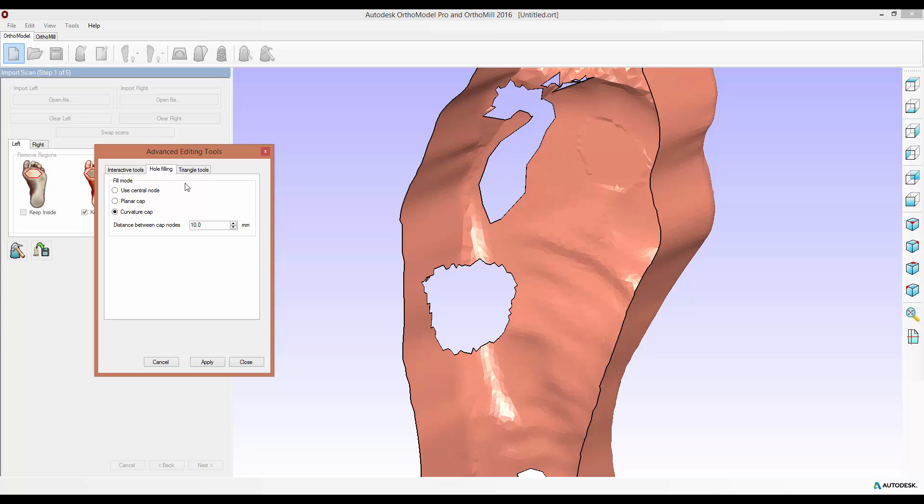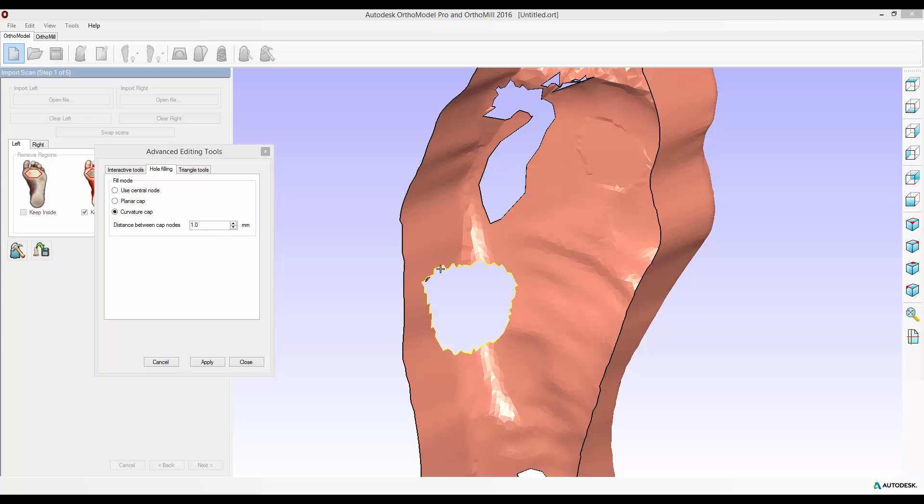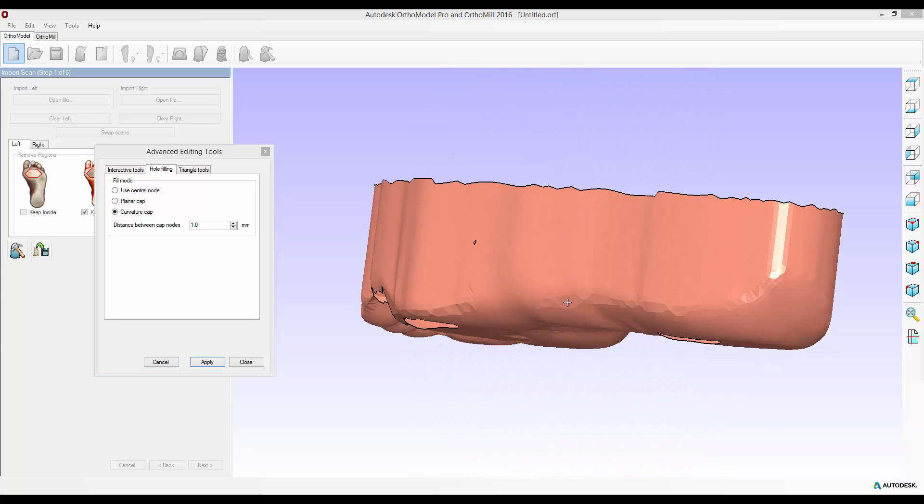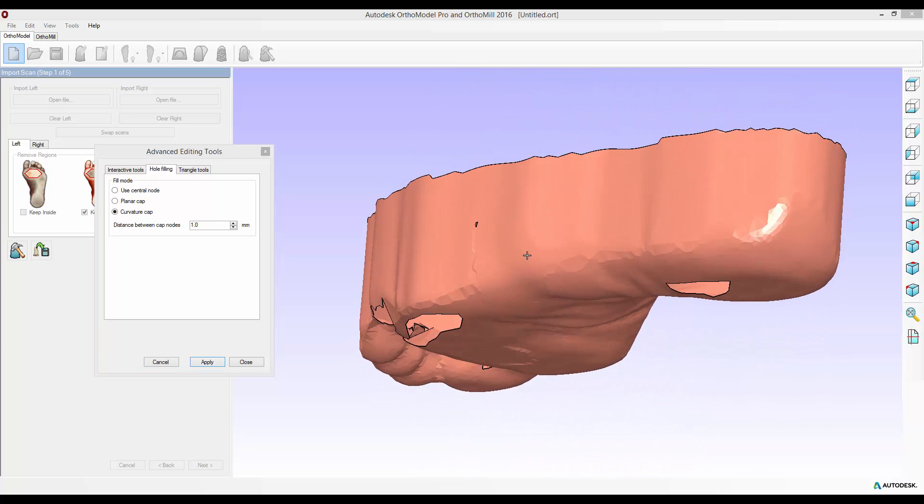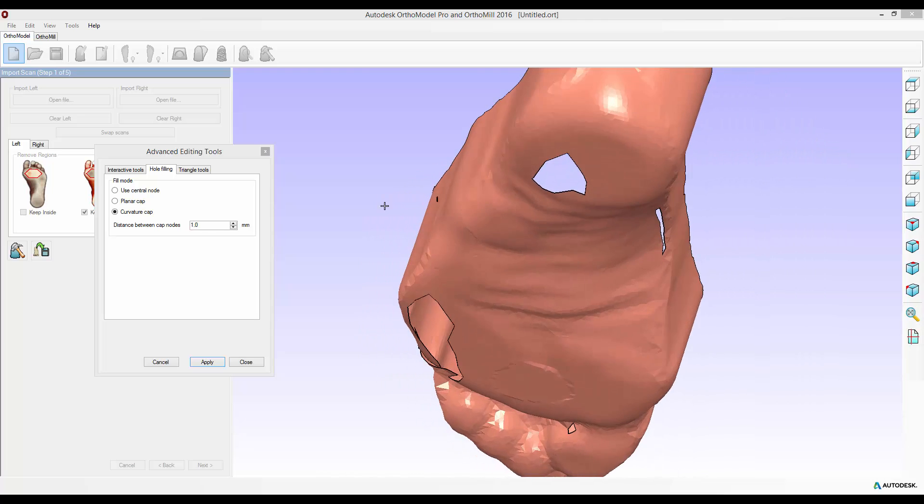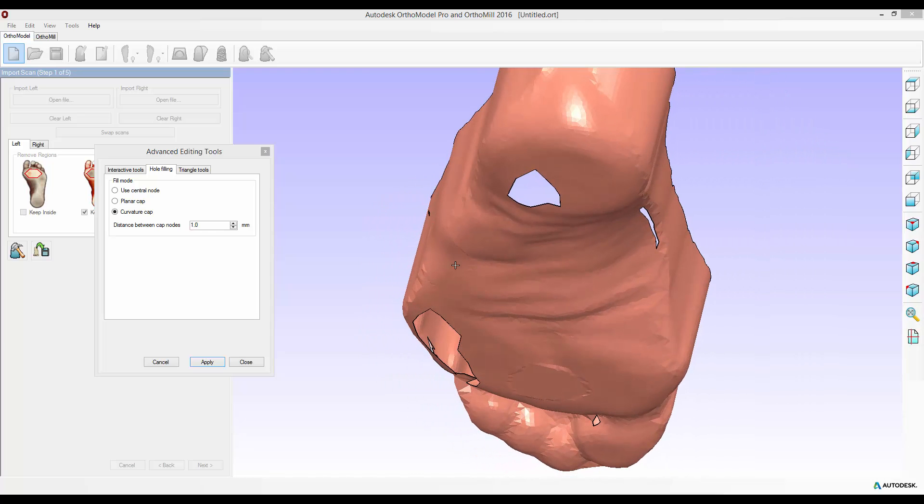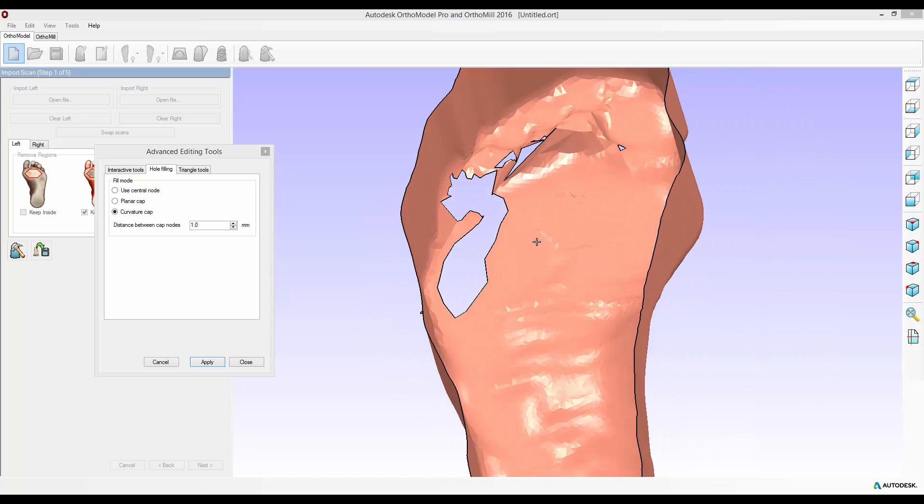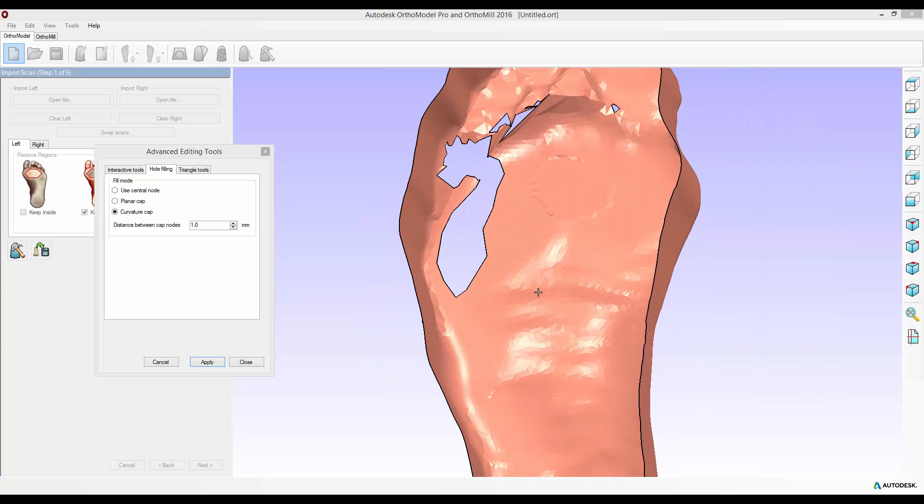I'll set this at one millimeter for now, select the hole and apply my hole fill. It still seems a little rough around the edges but if I scroll around you can see that it's actually followed the curvature of the side of the foot. It's a lot more accurate but it does take the longest amount of time of the three.